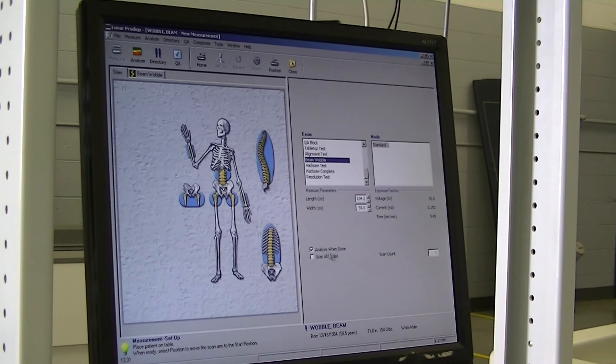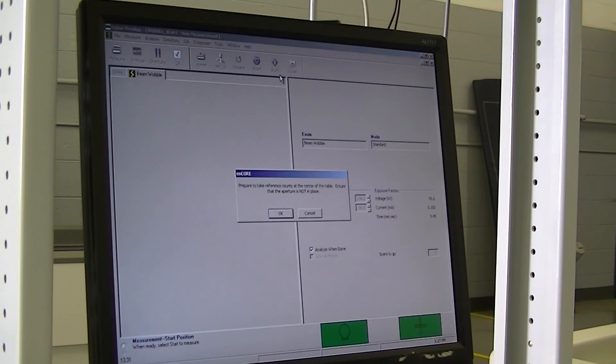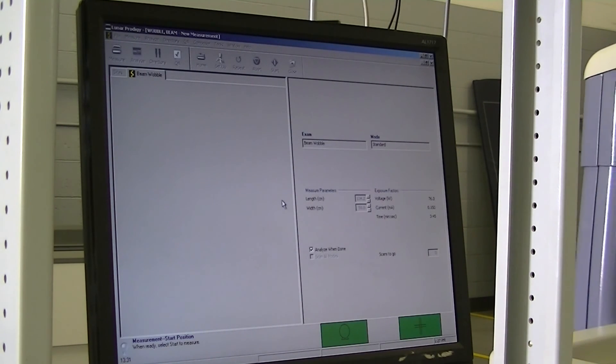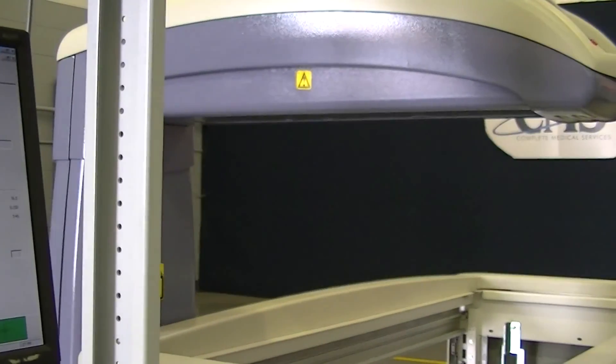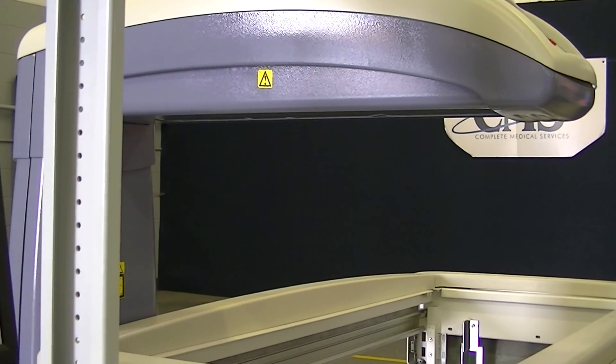To Beam Wobble Test. Make sure Analyze When Done is selected and hit Position. It wants to make sure that the alignment aperture is not in place. Make sure it is not in place. Hit OK. The arm is moving, and it's going to run the beam wobble test.